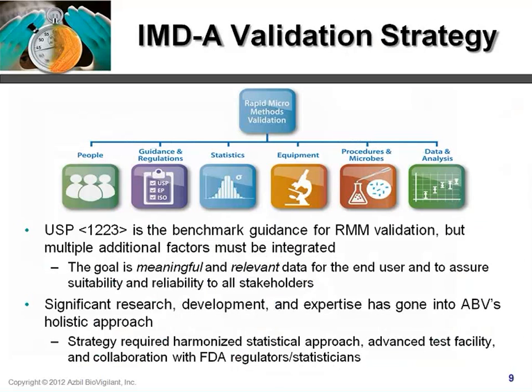So let's talk a little bit about IMDA validation. Rapid micromethod validation, RMM validation, is obviously an important topic for anyone considering an RMM application which falls under regulatory jurisdiction. And in a few slides, we'll talk about some of the different applications and which ones may or may not fall under regulatory jurisdiction.